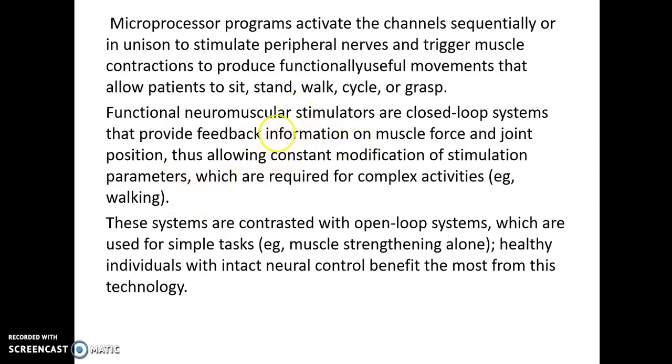So these microprocessor systems can be used as both closed loop as well as open loop, and mostly we are using closed loop mainly in implantation, whenever we are using implanted electrodes, and mainly for complex tasks such as gait. Gait is a complex task because many agonist, antagonist, synergistic and fixator muscle groups have to be stimulated using FES or FNMS.